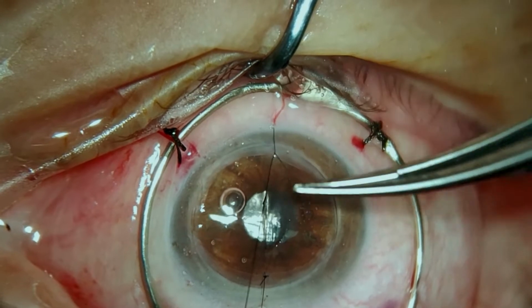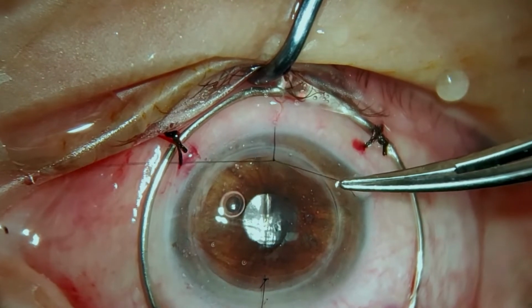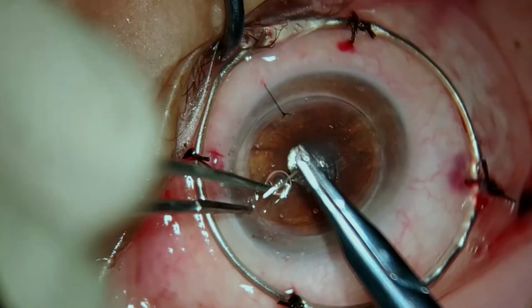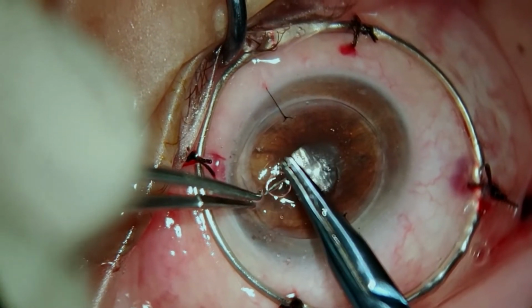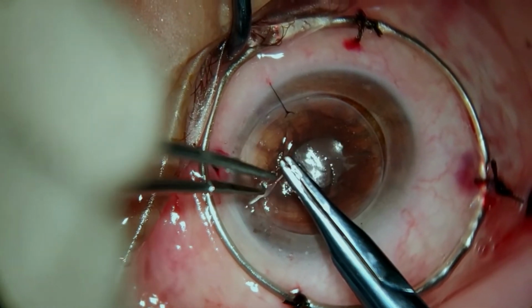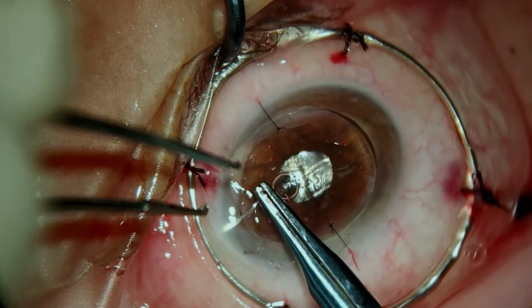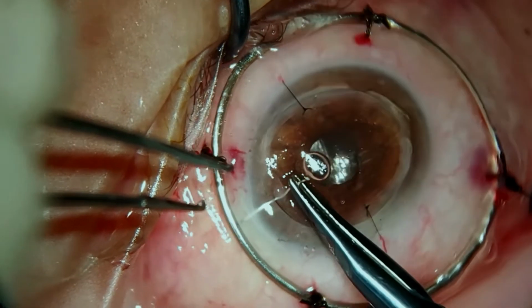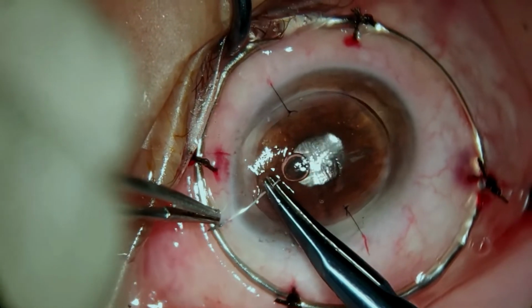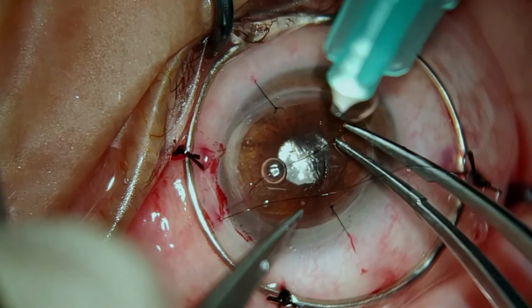Now, in terms of sutures, this is surgeon preference. What we do is a 3-1-1 knot. Sometimes locking the first three, other times not so much. It depends on the day, the surgeon, and basically what you're comfortable with is good enough. As long as you have a good knot at the end, it really doesn't matter how you get there. And a good knot means enough tension, but not too much, and good wound apposition, meaning that you're as deep in the host as you are in the donor cornea. And then not over tightening and not under tightening.